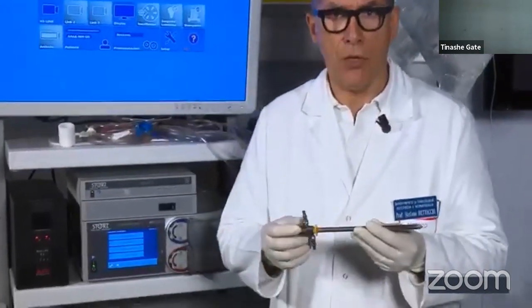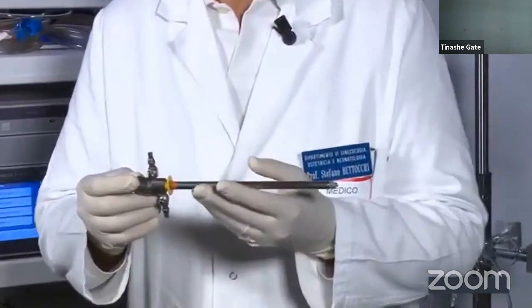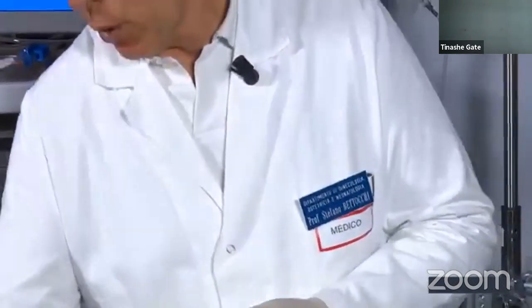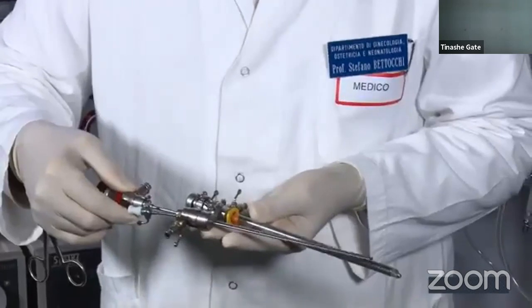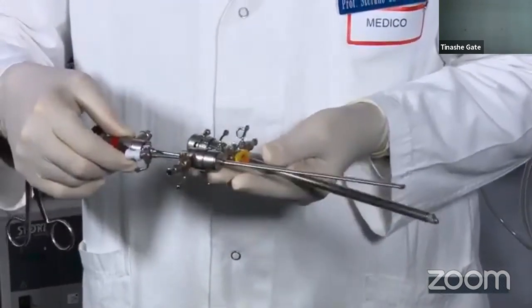There are scopes that we are used for, like the resectoscope. There are large instruments. This one, for example, there are the internal external sheath of the 26 French resectoscopes. It's close to 9 millimeters in diameter, while we have the most recent hysteroscope. They are ranging 4 millimeters. So you see immediately the difference. It's quite high, and I give you the two examples. So they are different. So you can imagine that the fluid inside these two scopes goes in a different way.